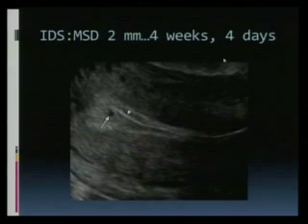A pseudogestational sac is blood or secretions or pus or what have you that is in the endometrial cavity. It is the content of the canal. Have I made myself clear? Please ask questions. If you don't ask questions, I assume you have understood everything.